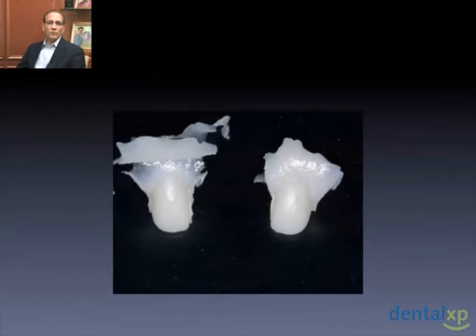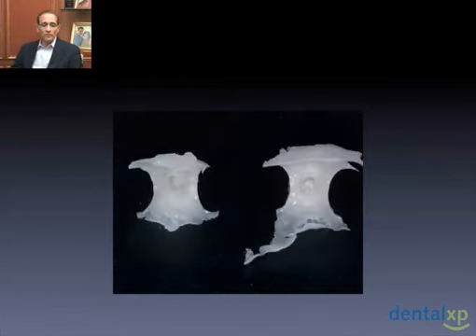When we remove it, this is what we start with. But as you can see, we have captured not only the tooth form that was created from the diagnostic wax-up that we've mimicked in our matrix, but we have some excess, which is good, which is exactly what we want, because we're going to need more at this stage to fill in the gap that's created between the provisional and the provisional abutment as it is right now.